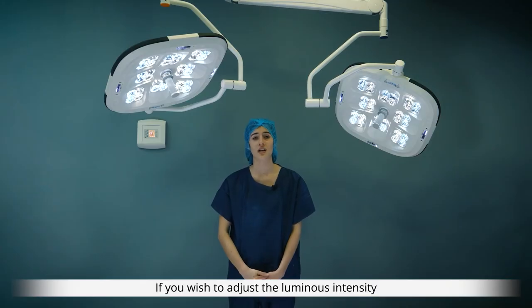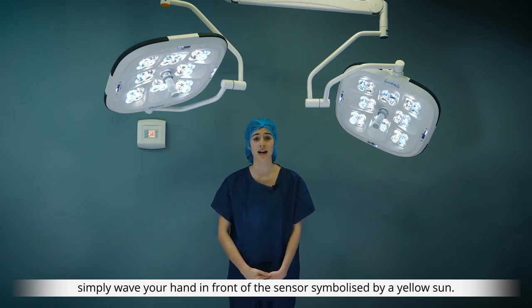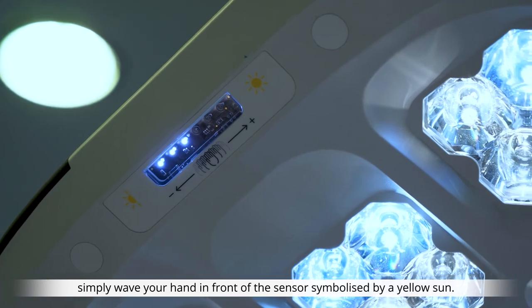If you wish to adjust the luminous intensity between 50,000 and 160,000 lux, simply wave your hand in front of the sensor symbolized by a yellow sun.